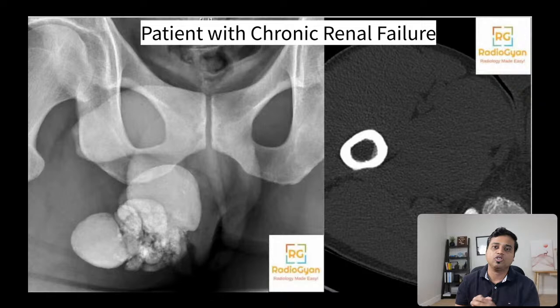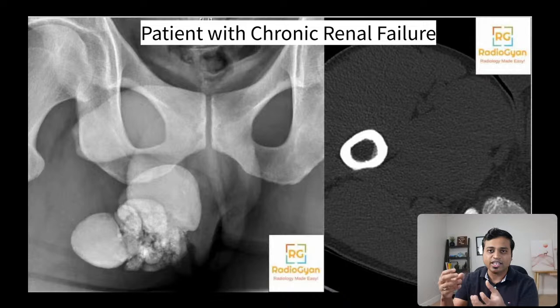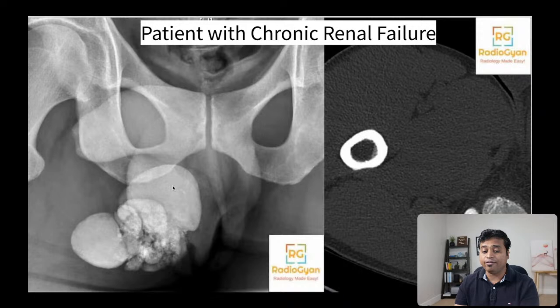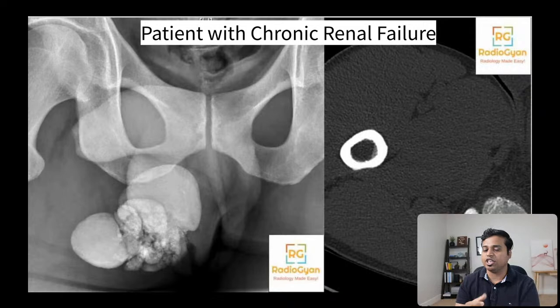What we see here is this calcified lesion involving the posterior buttocks. There are very few differentials for calcifications in this region. Calcific tendonitis is one differential, but that would be close to the attachment of the hamstrings at the ischial tuberosity — this is far away from that and medial to it. Myositis ossificans is a good differential, but this is homogenously calcified, whereas myositis ossificans will have peripheral dense and central less dense calcification. This was tumoral calcinosis, and this fits with the history provided.